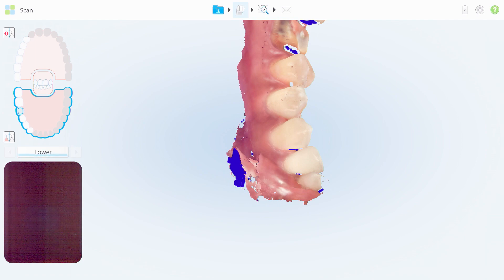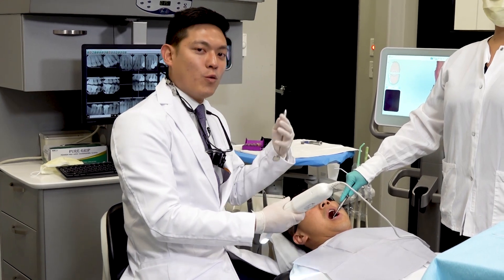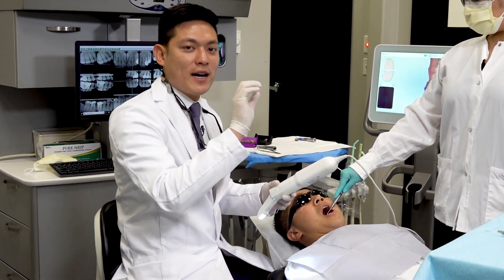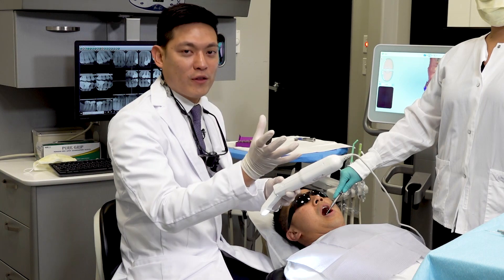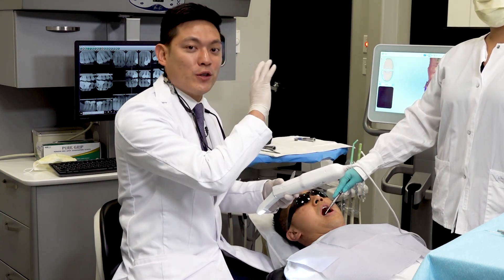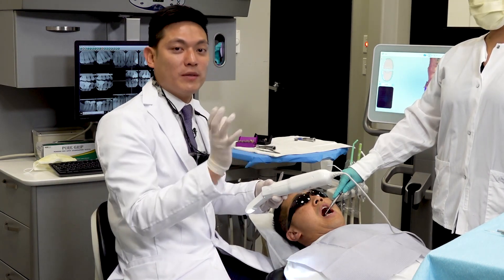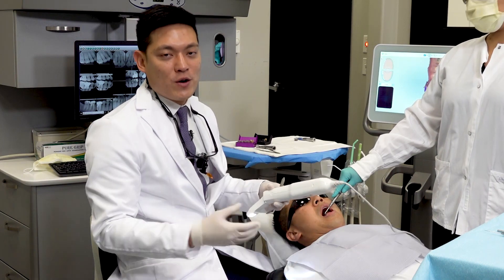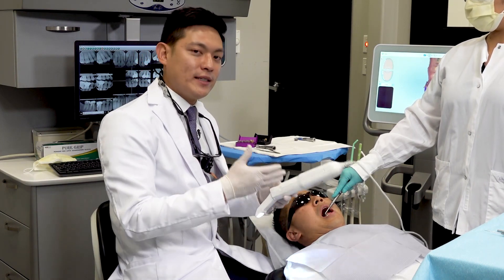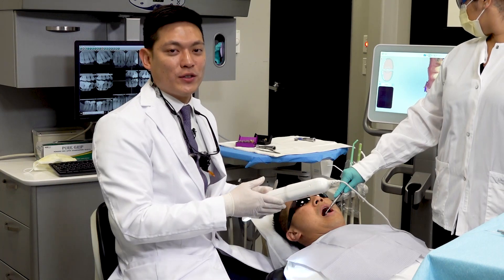Moving slowly is also going to be important to avoid distortions. One of the critical aspects during the scan is to analyze the digital model as it's generating. Watch the screen, watch where your position is, and watch the data get added to your model. If you notice any strange area — like you know where you're scanning over the canine, but the system put it at a weird angle or incorrect position — you want to try to catch that early on. Because if that happens due to a misalignment, from the area being too wet or too hard of a rotation, it can throw off the accuracy of the scan. It's ideal to capture it then, delete those incorrect areas, and continue on with your scan. Sometimes it might even be easier to just start over.